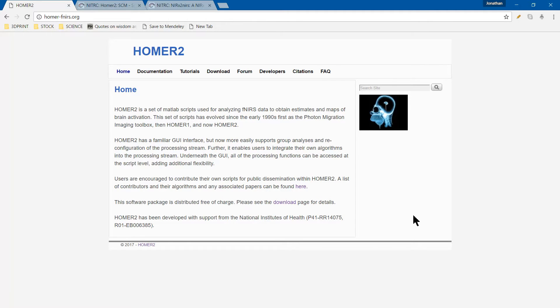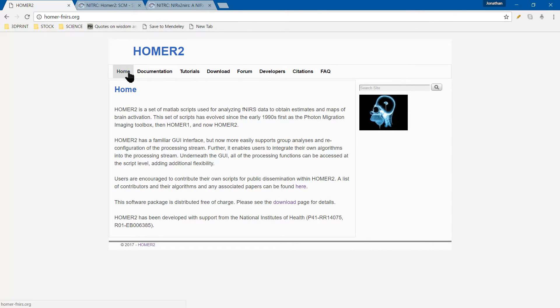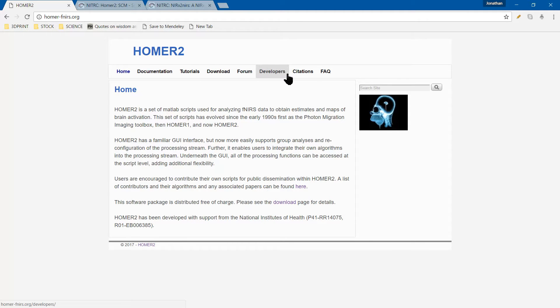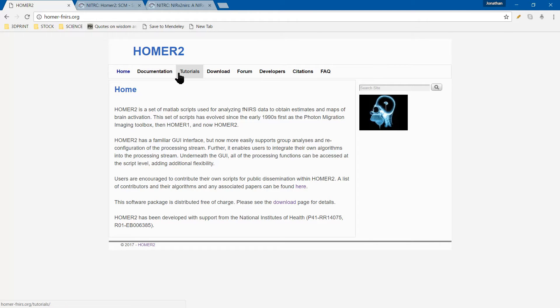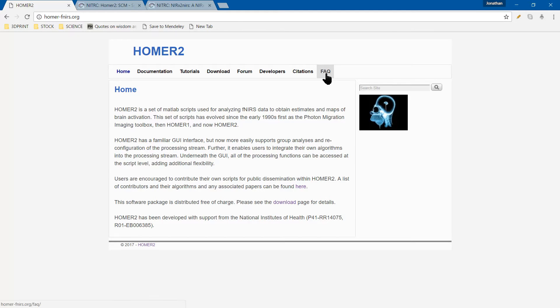First things first, you head over to the HOMER website at homer-fnirs.org. Once you're there, you have several tabs: home, documentation, tutorials, download, forum, etc. The most helpful ones will be the tutorials, the download, and the forum, and this FAQ link over here.